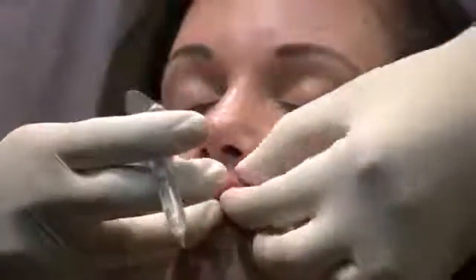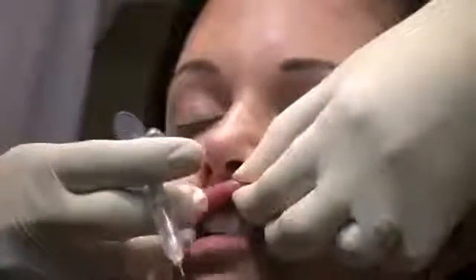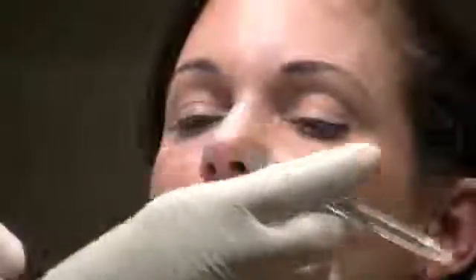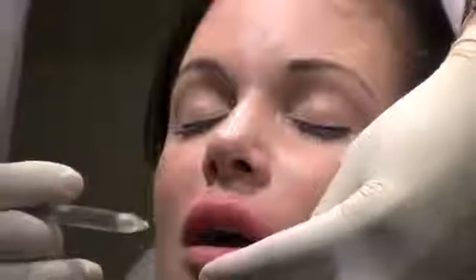After I fill the first round, I do two things with my hands. One is I feel how much filler I have on each side. The tactile sensation definitely helps make sure we have a symmetric fill. The second thing it does, as you fill the lips, by smoothing it out, you don't have any lumps or bumps or nodules. Doing okay? Mm-hmm. Okay. Keep the mouth open.